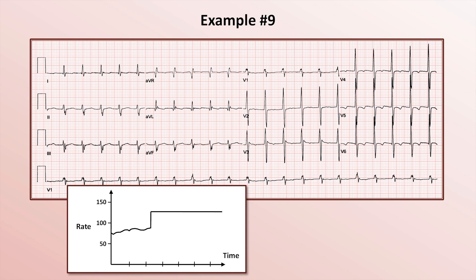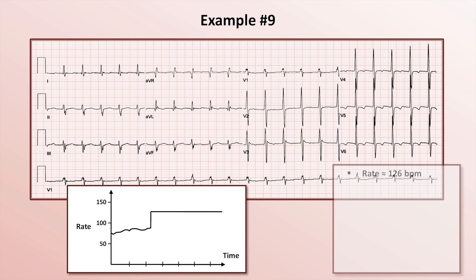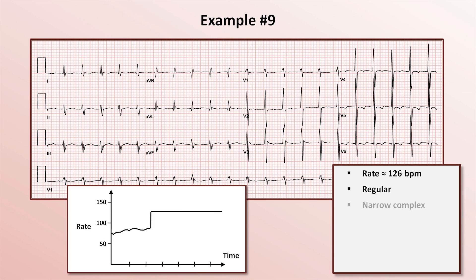Going through the six questions, there are about two and a half large boxes between successive QRS complexes, suggesting a rate in the mid-120s — more precisely about 126 using the 10-second rule. It's regular and narrow complex.